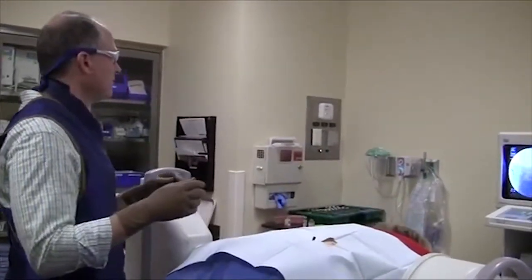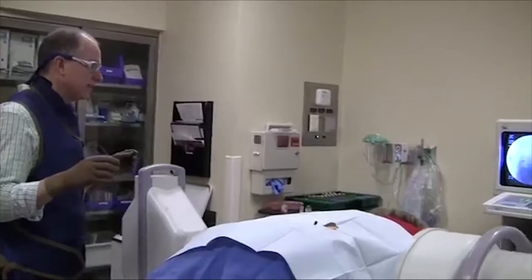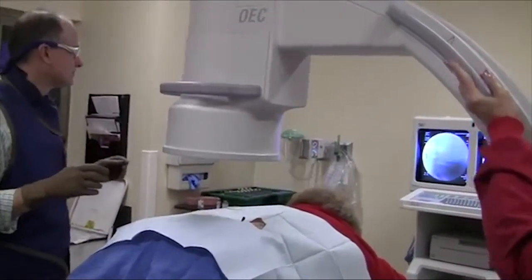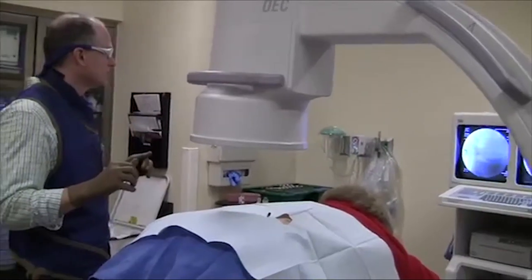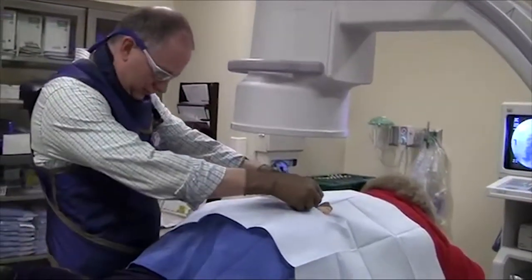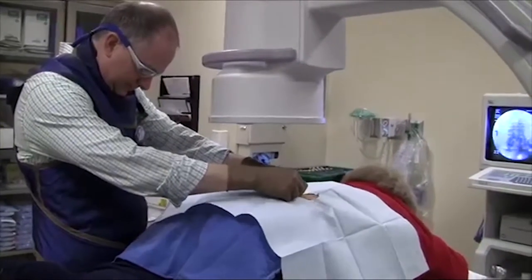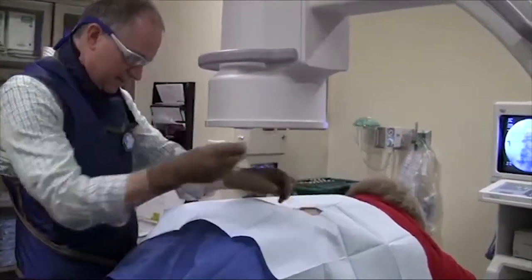Once the needle is felt to be in the correct location based on the imaging, the patient will be injected with x-ray dye in order to safely identify that we are in the exact location that we need to be in.